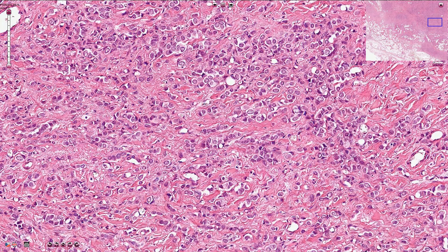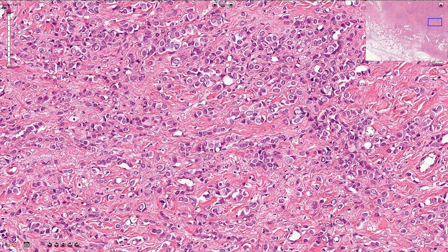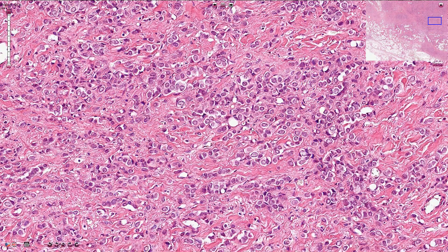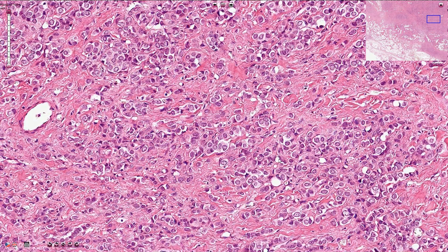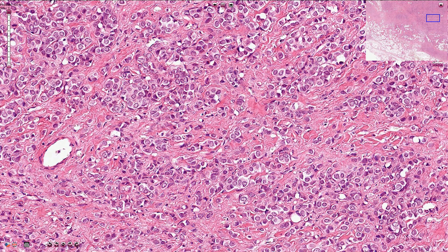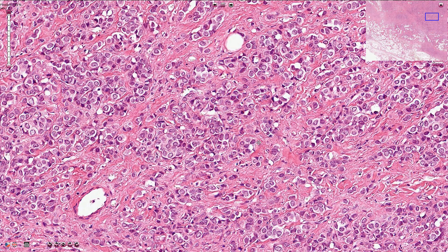The cells are typically round with round nuclei. The cytoplasm could be slightly eosinophilic or clear because of the mucin content, and sometimes we can even see signet ring cells with large mucin vacuoles inside the cytoplasm. The cells are typically negative for E-cadherin on immunohistochemistry, which is associated with the missing E-cadherin protein.